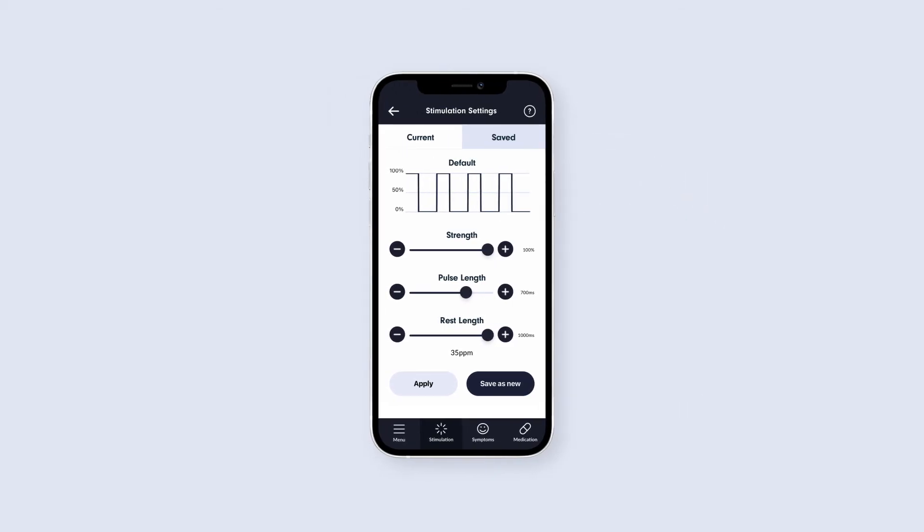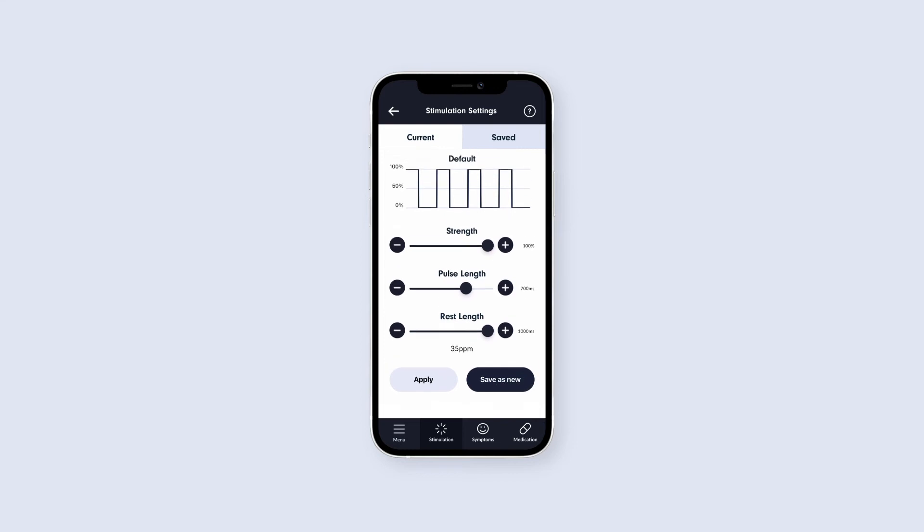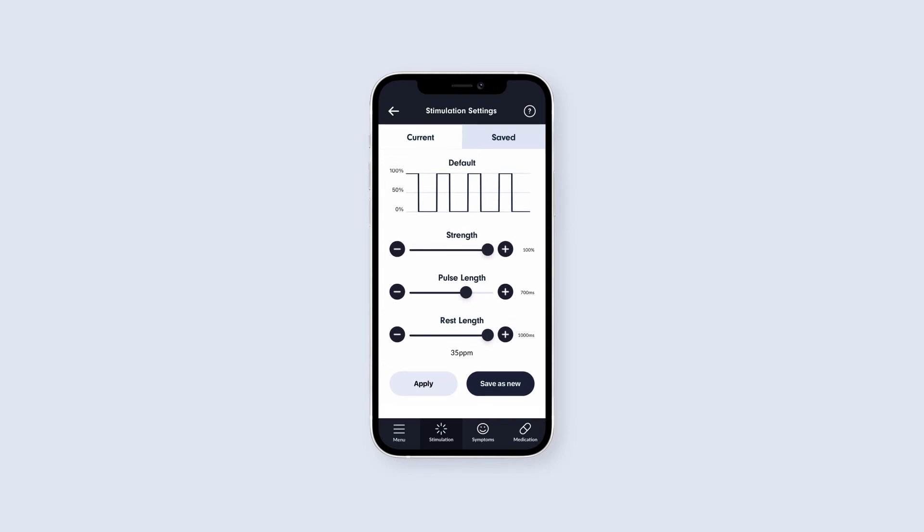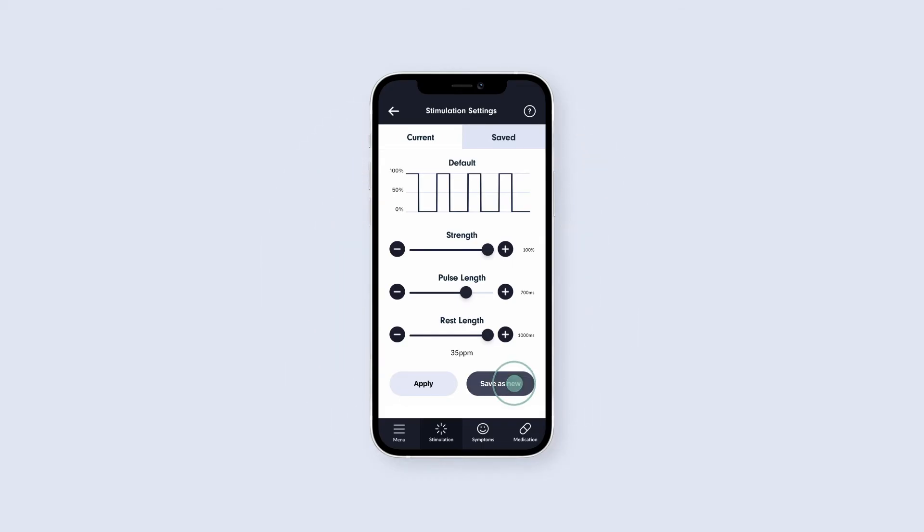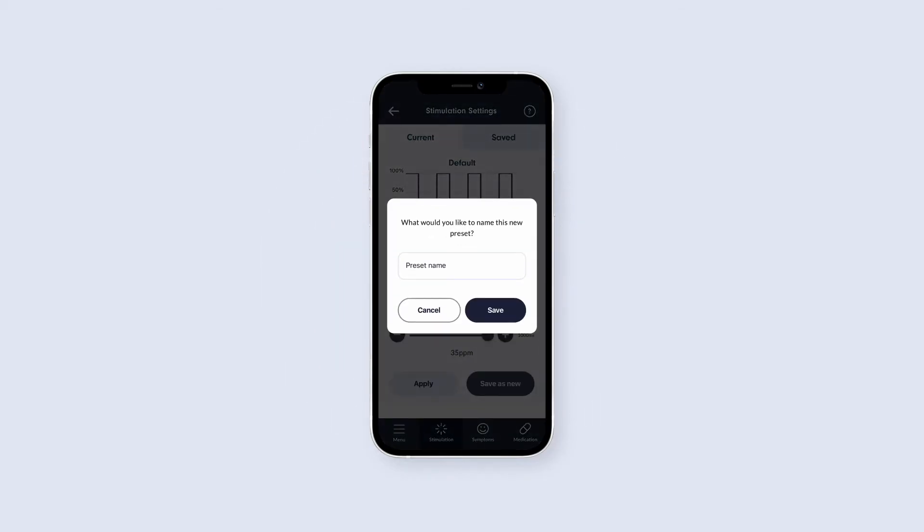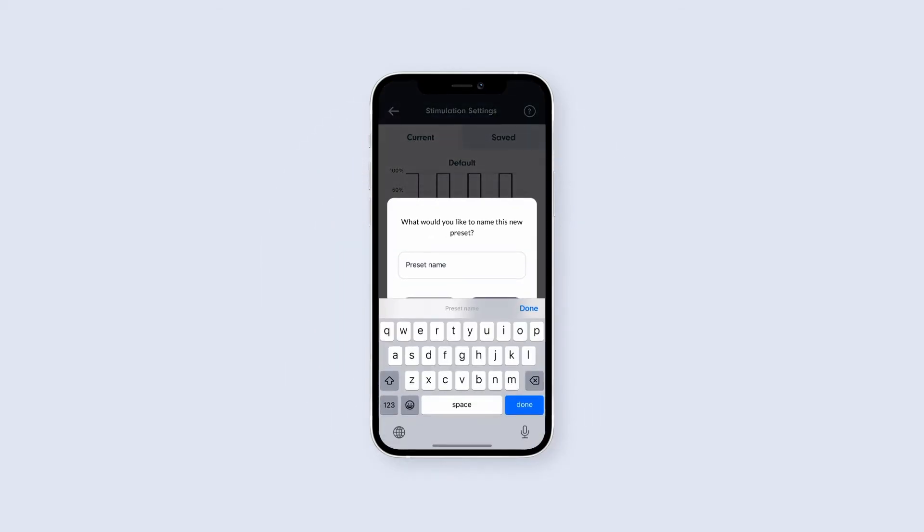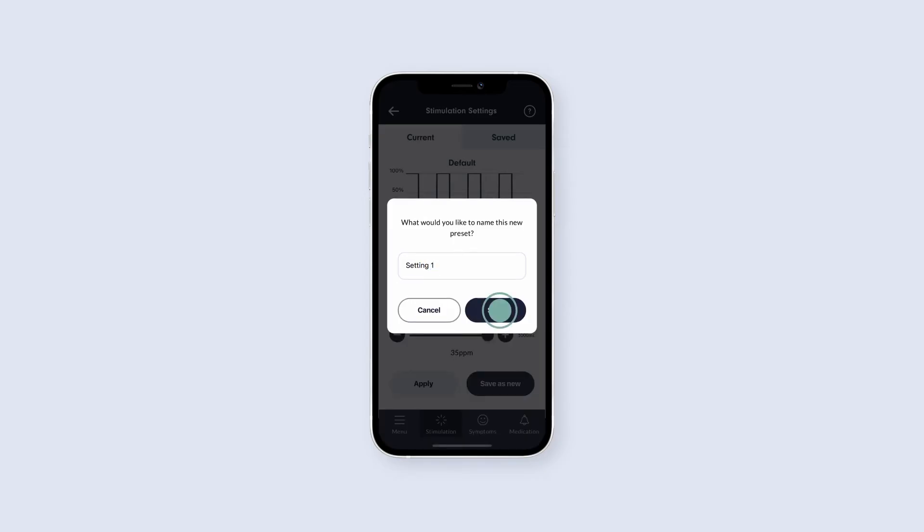Once you've adjusted the sliders, make sure to tap Apply or Save as New at the bottom of the screen. You may need to scroll down to see these. Pressing either of the buttons will change the current stimulation settings on your Q1, but the Save as New function will also save this specific stimulation configuration on the application, so you can easily return to it in the future.